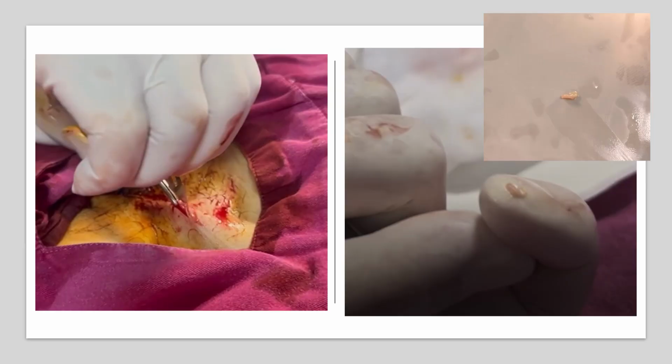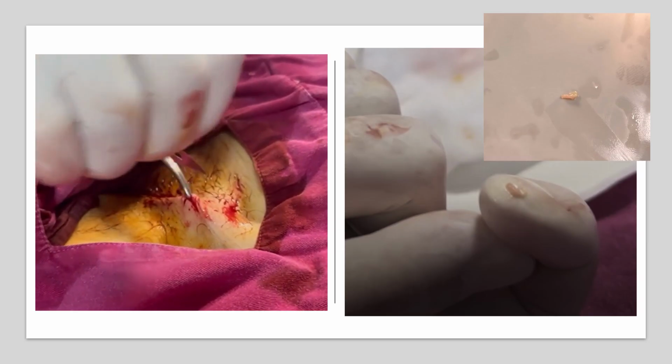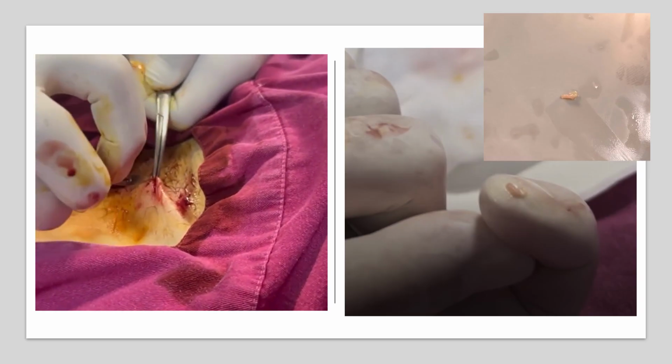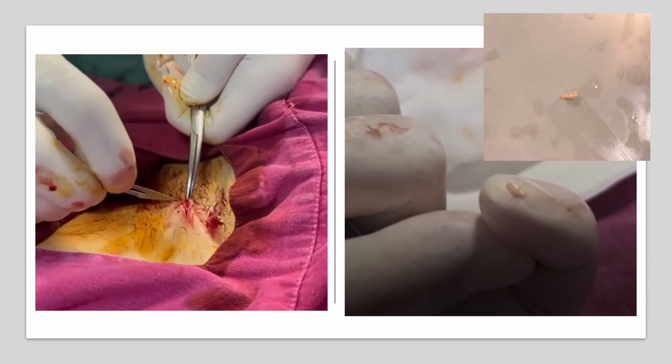You are currently watching the video we shot after the procedure to better explain it. A subcutaneous fat excision was performed from the patient's femoral region after local anesthesia for the fat sample.